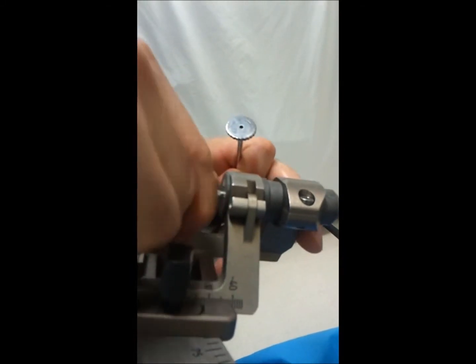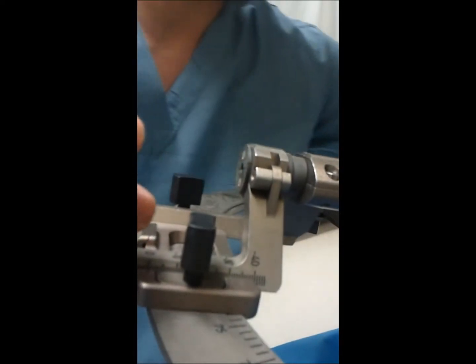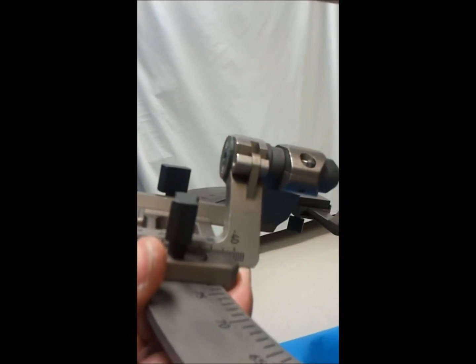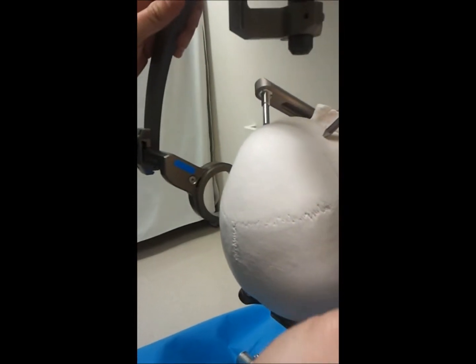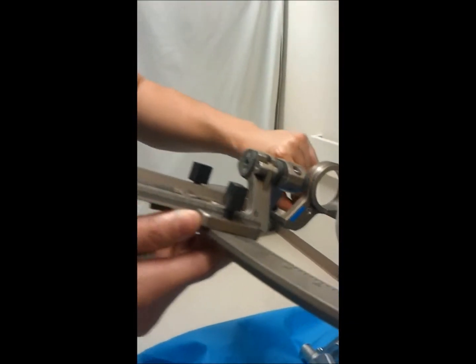to make sure that it doesn't get contaminated as we're moving things around. And this ring can be moved up out of the way temporarily, and a burr hole can be made. Now the last thing I didn't talk about, even though I moved the arc coordinate, is the ring.